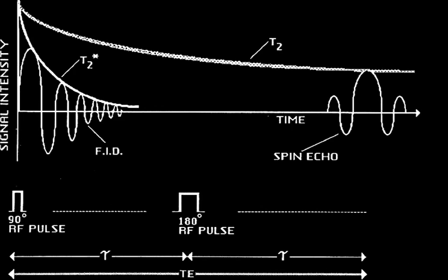Yes. So once those nuclei, the spins, rephase, an echo is given off. It's what they do. They rephase. Then the bulk magnetization vector goes from 0 in the XY plane to a non-zero value in the XY plane.